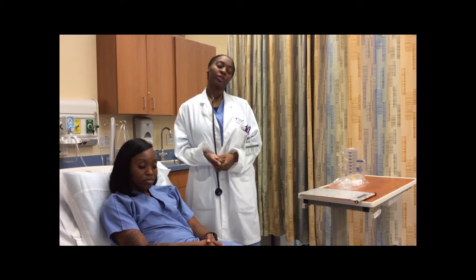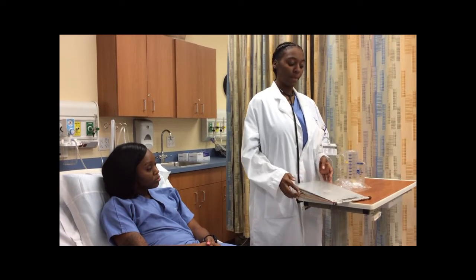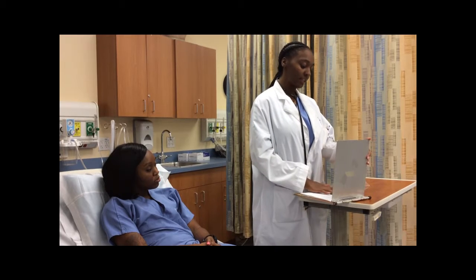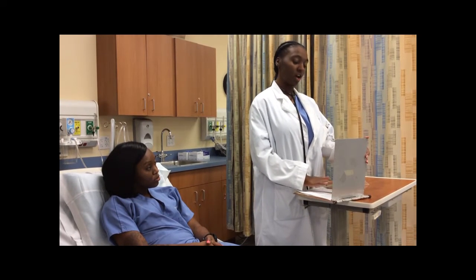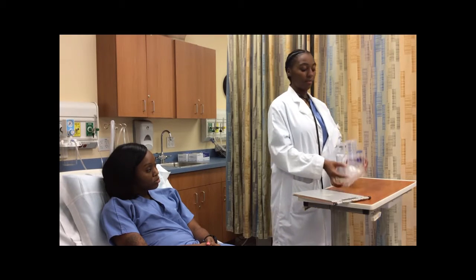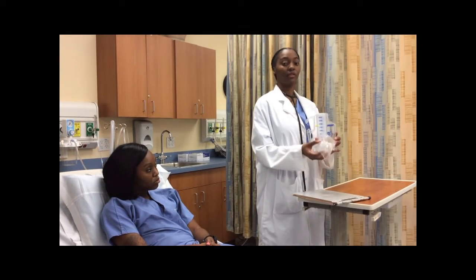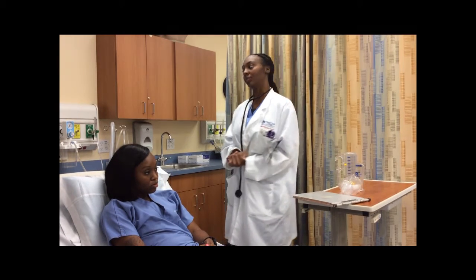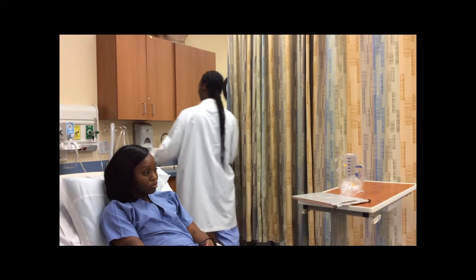I start my demonstration with the MD orders. I verify the MD orders. I check to make sure are there any indications or contraindications. I gather the equipment, which is the mouthpiece and the incentive spirometry device. And now I'm going to wash my hands, and I'm going to don my PPE. And I'm going to wash my hands for 15 seconds.